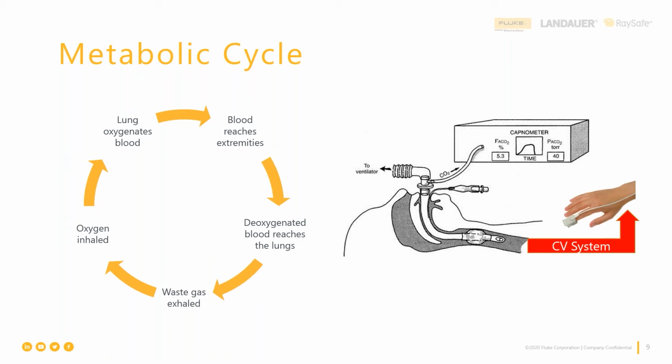And so it's a measure of the health of both the blood interface with the lungs and the lungs themselves, in terms of getting this gas exchange in a proper range. So it's all part of the picture. Today, we're just focused on the perfusion side. That is the part where blood leaving the heart is full of oxygen to distribute to each of the cells in the body, and then leaving those boxcars open to collect carbon dioxide so it can be exhaled by the lungs. Both technologies give you the full picture of what's going on with the body's metabolism, but today we're going to focus just on SpO2.